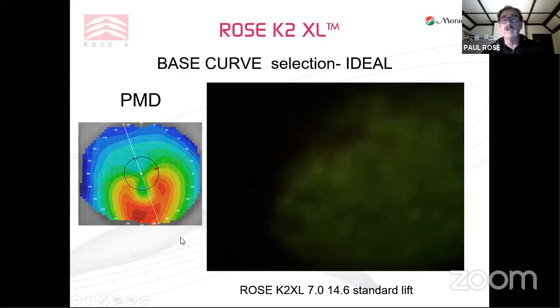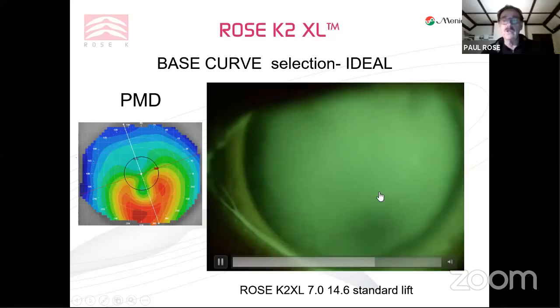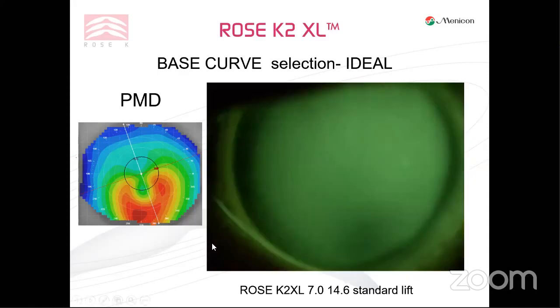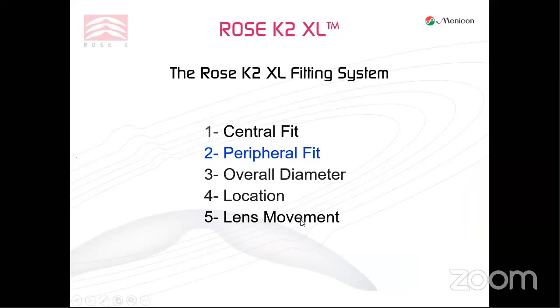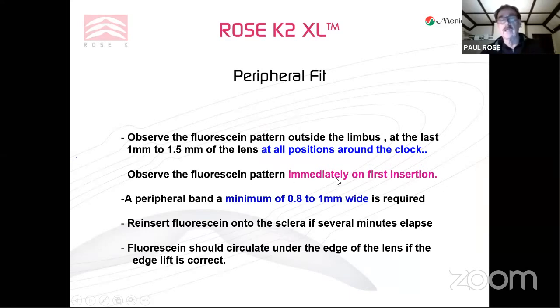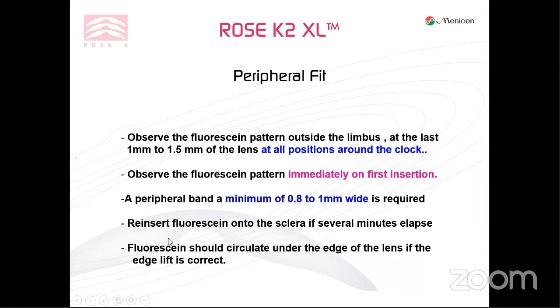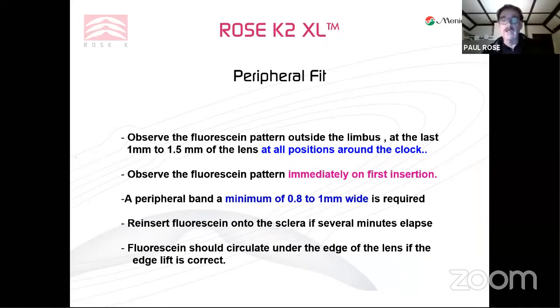Here is a pellucid case — we look for the steepest part at 270, not superiorly as with typical cones. You can see at the highest point, when the patient blinks, touch just appears and then disappears — quite acceptable. Now, peripheral fit: observe the fluorescent pattern outside the limbus at all positions around the clock. You can judge the fluorescent pattern immediately on first insertion. You're looking for a band of fluorescence at least 0.8 to 1 mm wide or even slightly wider. You can reinsert fluorescence onto the sclera — if you put it in the bowl of the lens and don't look at the edge lift immediately, it will dissipate and look tight.